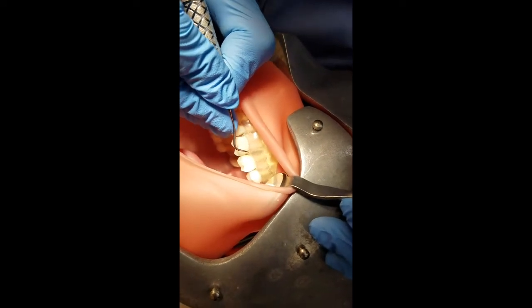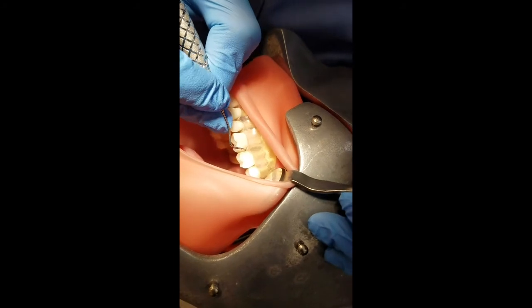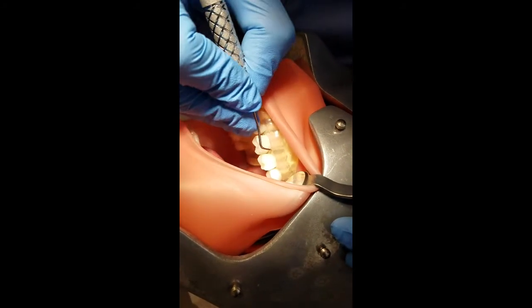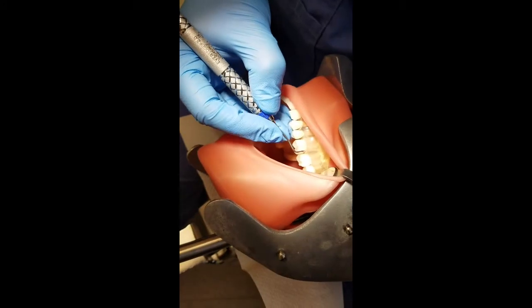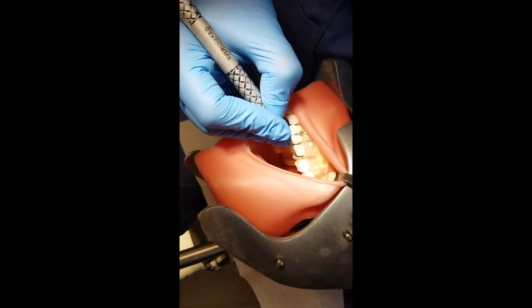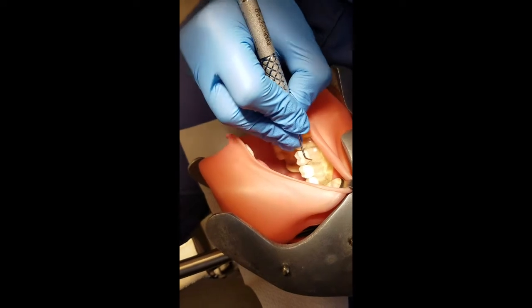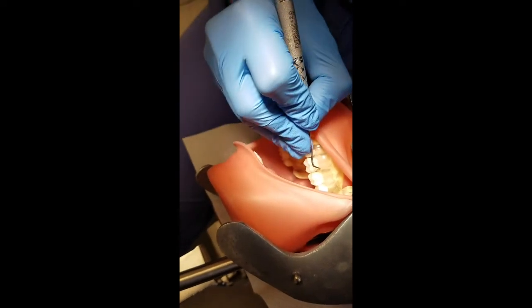The distal and mesial line angles of the teeth will be a vertical stroke. Adapt your instrument at the height of the stroke so as not to harm the tissue. Rest and repeat stroke until your tip has reached under the contact area. Explore, tilt, scale, explore, tilt, scale.